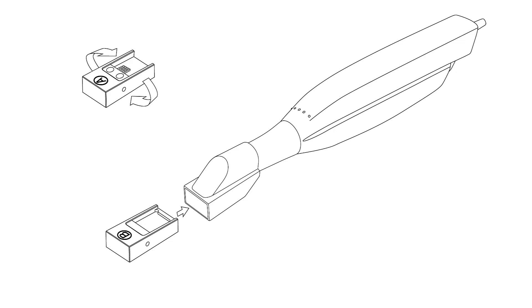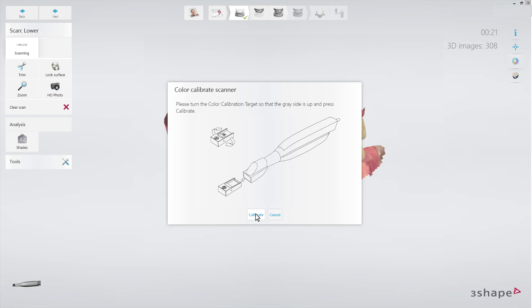Upon doing so, reattach it to the color calibration adapter and press Calibrate to start validation. It takes around 30 seconds.